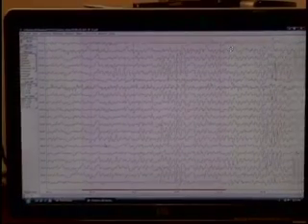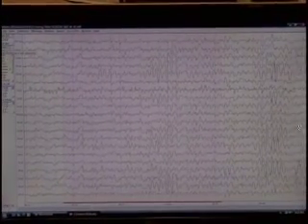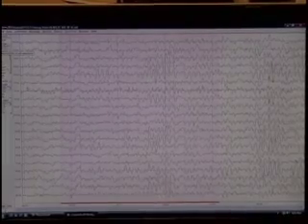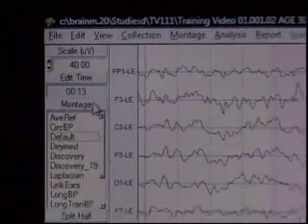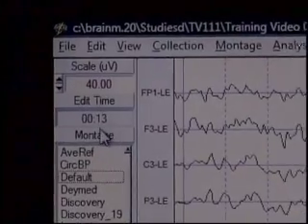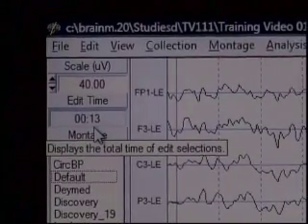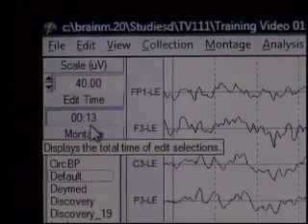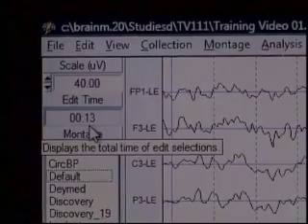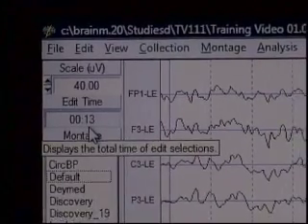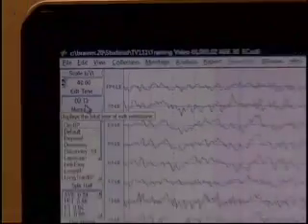I'll grab this portion here and let it go. Having picked that much, I've now picked 13 seconds. In the NeuroGuide window under Edit Time, it now says 13 seconds. Always pick at least 10 seconds of clean EEG before you use the automatic selection algorithm.